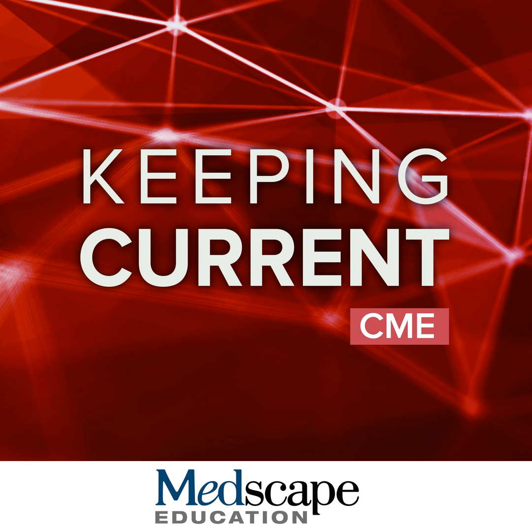So if you image at a time point called the inversion time, whereby the normal myocardial signal is completely nulled, you get minimal signal from the normal myocardium, but maximum signal from the short T1 myocardium, which is the myocardium containing the contrast. And that's how we do inversion recovery delayed enhanced imaging.